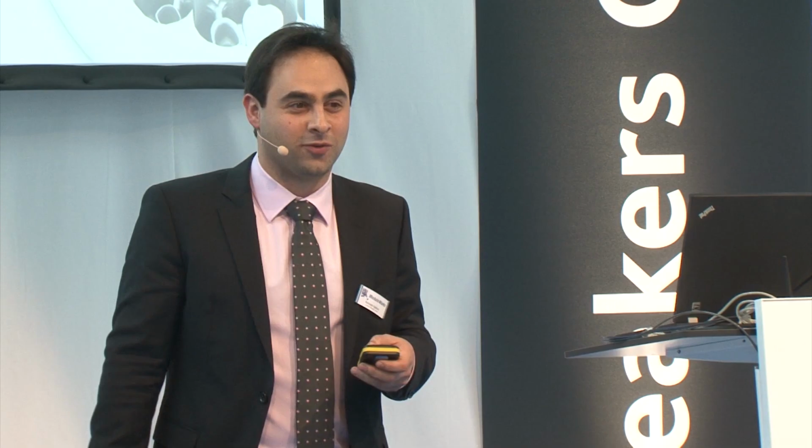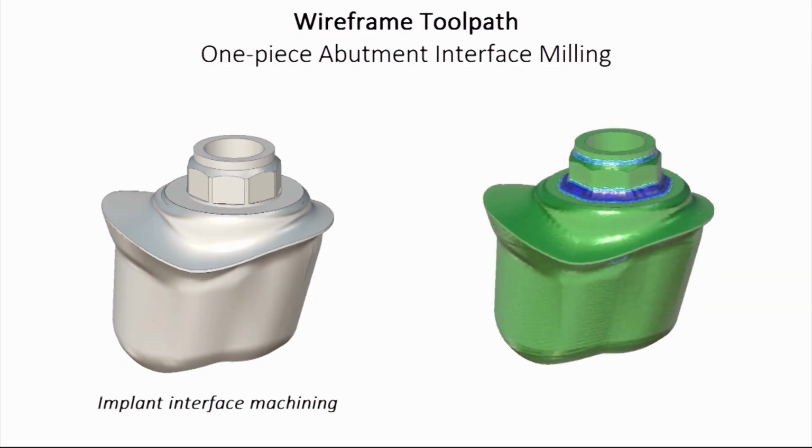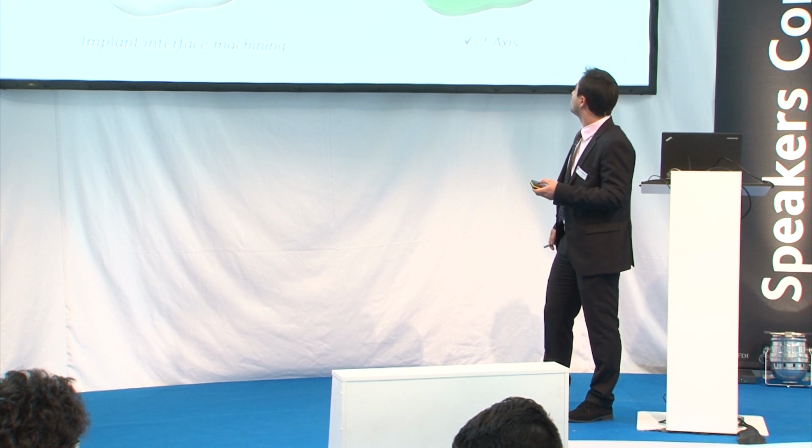There is another type of interfaces as well, which has this complexity on so many different edges and different elevations. Once these critical areas are marked in the CAD data, we can generate a toolpath based on our wireframe kernel and force the tool to remove these rest materials on these corners. This feature is available in 2-axis and also 5-axis mode.